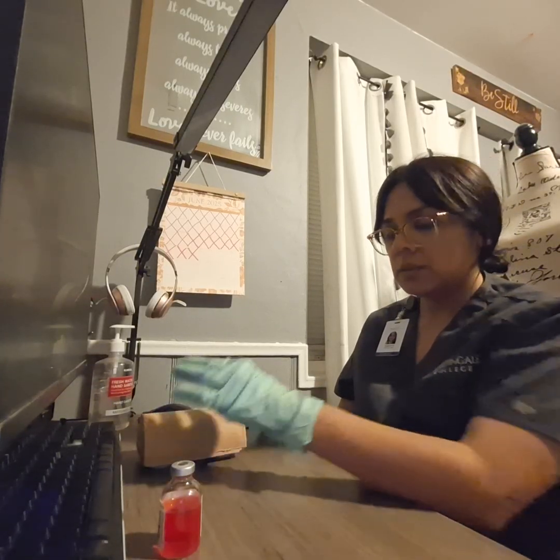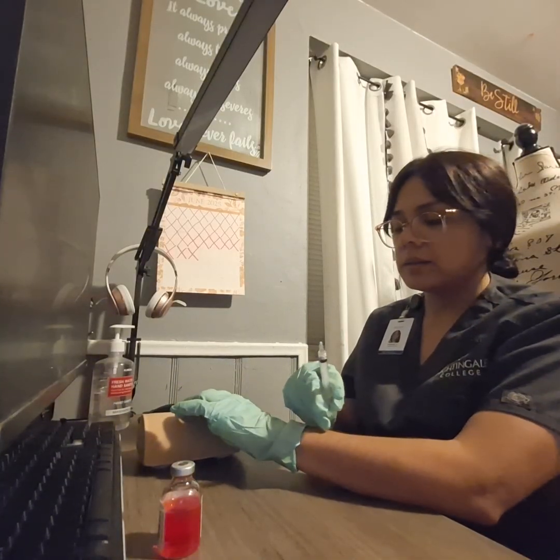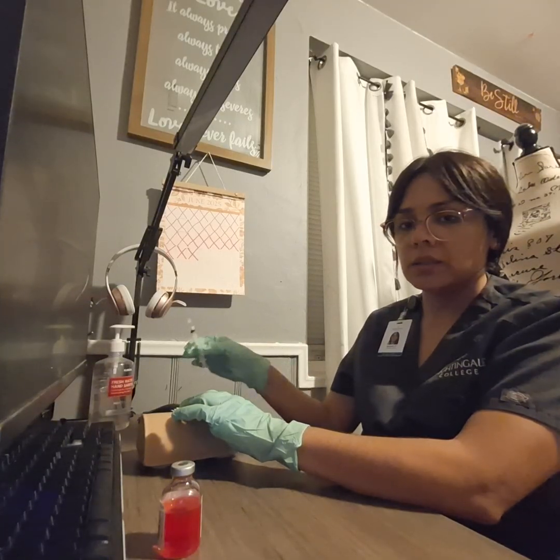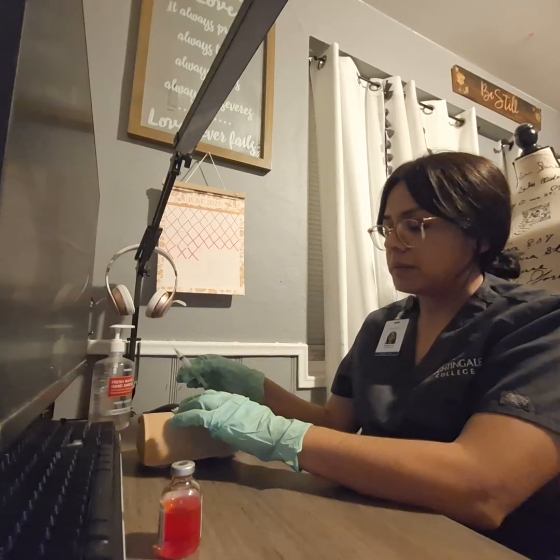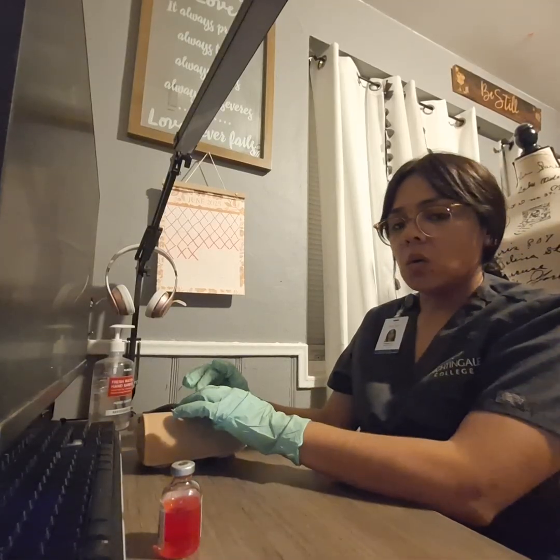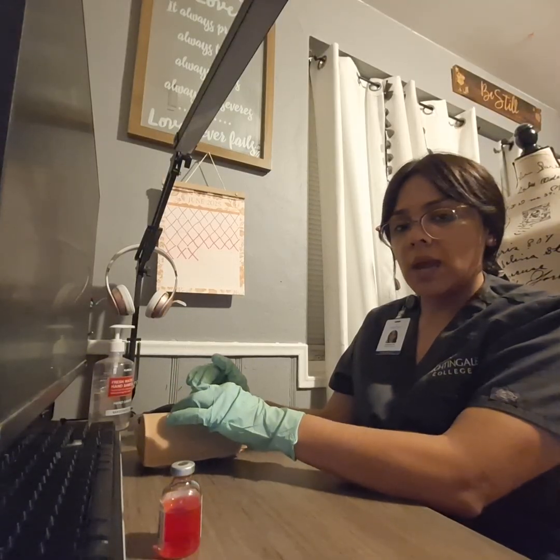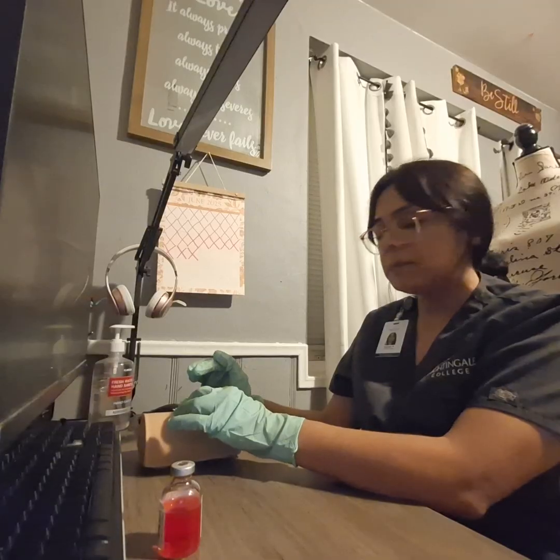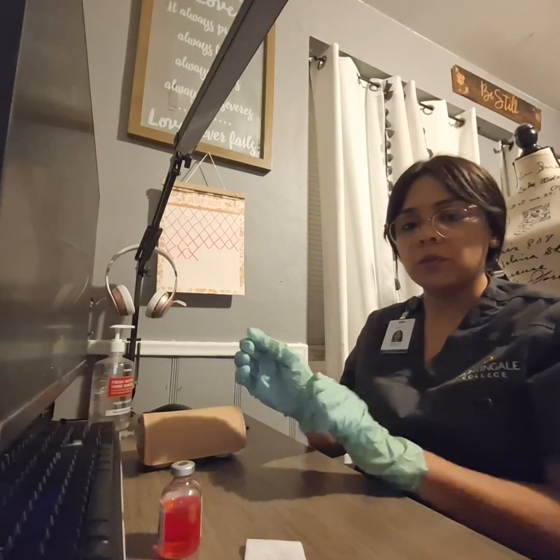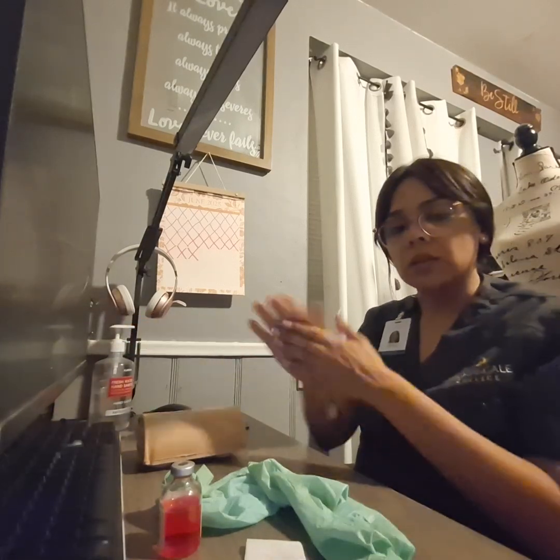I'll take a gauze, place it over the injection site, and remove the syringe. If the needle had a safety mechanism, I would lock it and dispose of it into the sharps dispenser. I'll make sure to hold the gauze over the site for over 30 seconds because it is a heparin injection. If needed, I'll place a bandage over the area. I'll clean up, remove my gloves, perform hand hygiene, and go document my procedure.